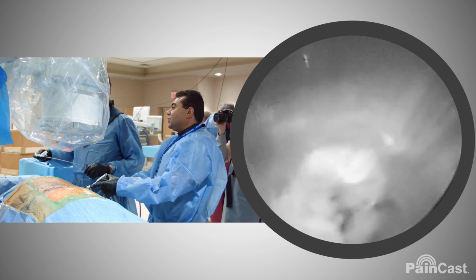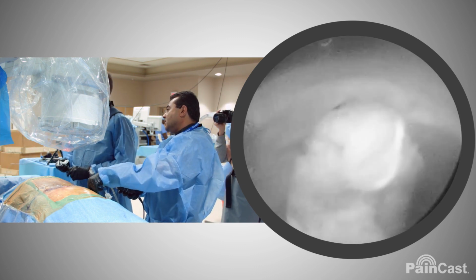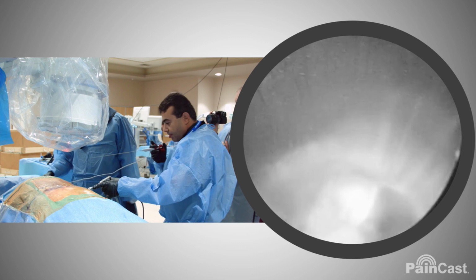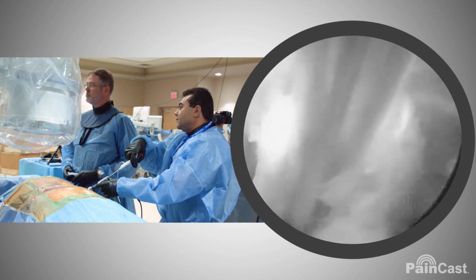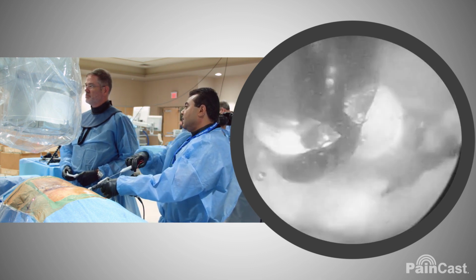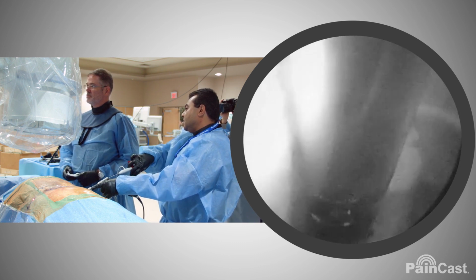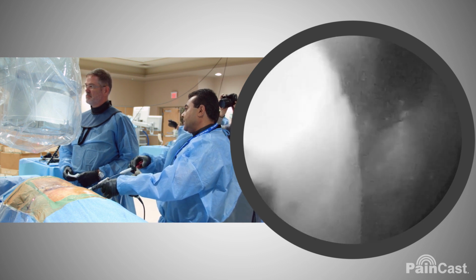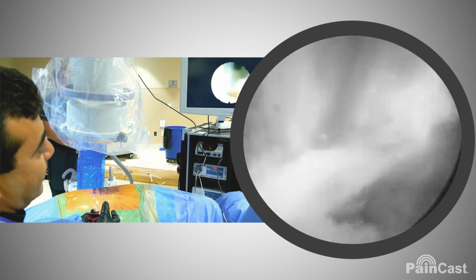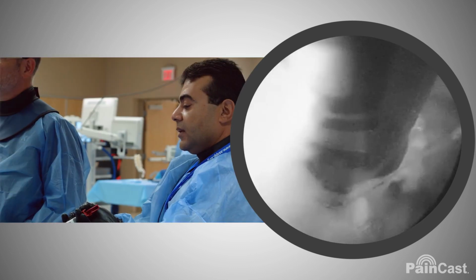So here we are at the edge of the annulus. You can see that's epidural fat. You get your radio frequency. You do your decompression, and you just define the anatomy. You don't want to ever go up here, that's the epidural space. You want to decompress here, and that is decompression.